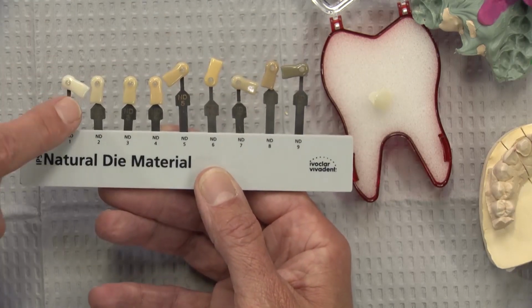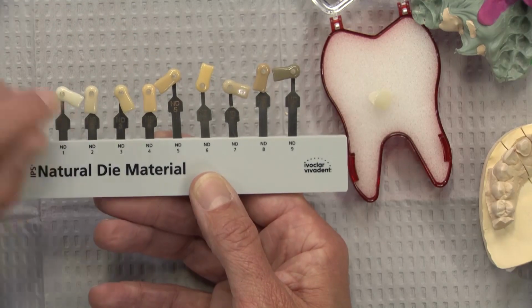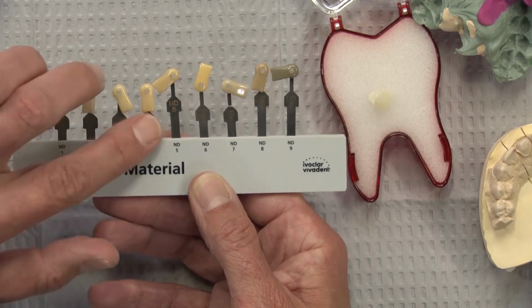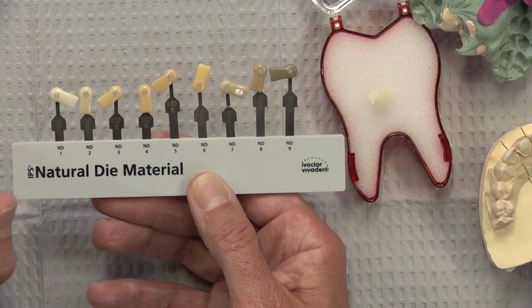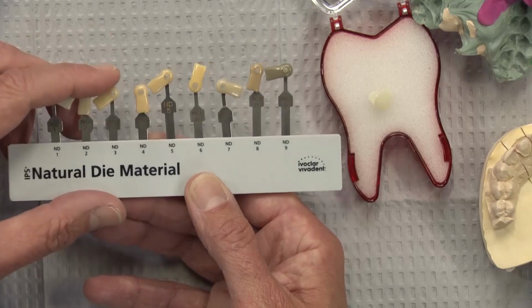And so these four, you can get away with almost anything on top of it, whether it's e.max or anterior BruxZir. In this range, it's going to work fine, but you're going to get grays and other colors bleeding through on the 5 through 9.